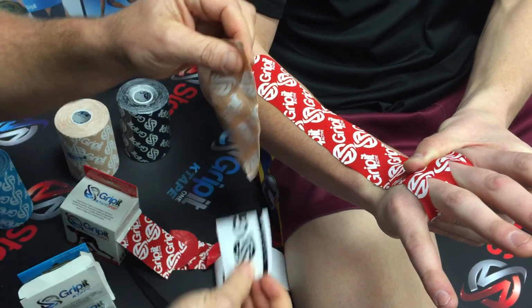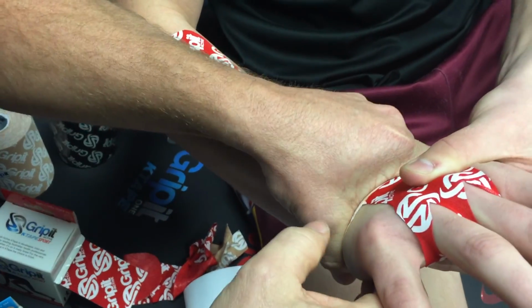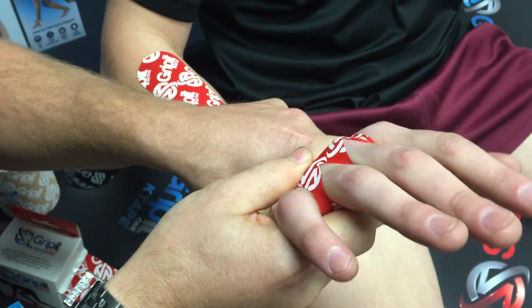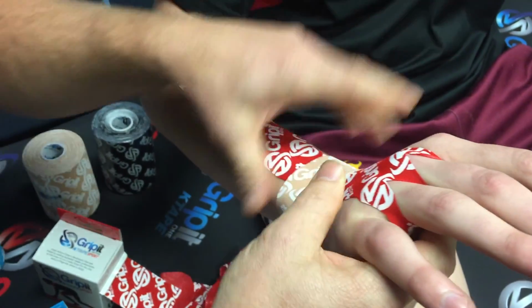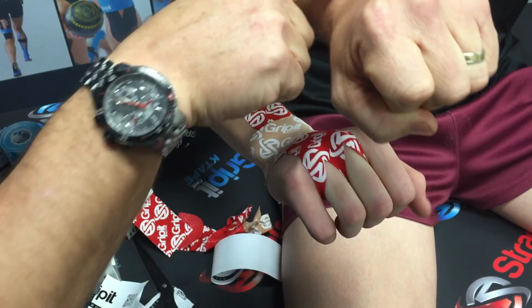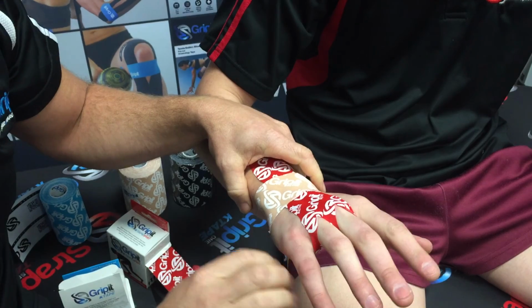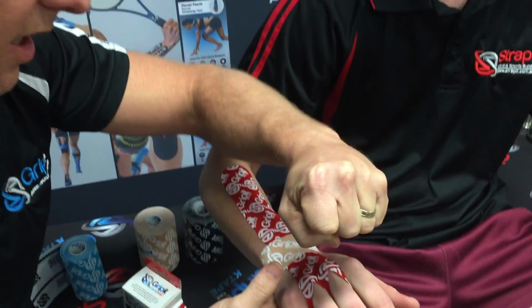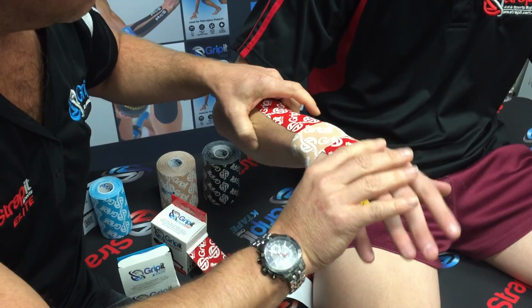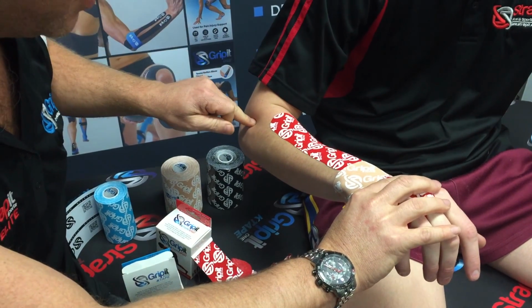Okay, so we lay that over the proximal crease there. Okay, and so the effect of that, and just let go of that now, buddy. So what will happen now is that as Daniel drops his wrist, he feels that, you'll feel that, mate, yeah. So what happens is that normally when the wrist drops, these muscles work really hard to eccentrically lower the wrist. But what Daniel now will find happens is that rather than these working eccentrically, which is just a technical term for a muscle contracting while lengthening, the muscles underneath actually work to drop his wrist, which means these guys get a break, which guess what means that the tendon insertion gets a break, okay?